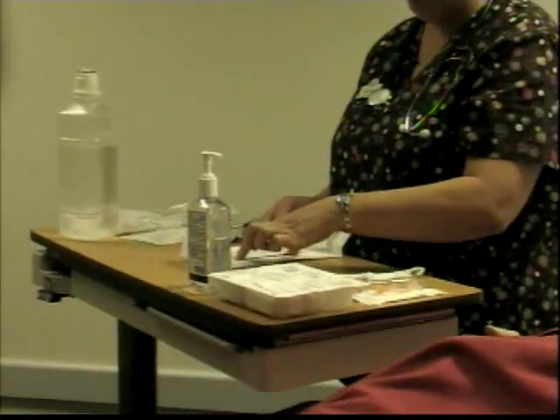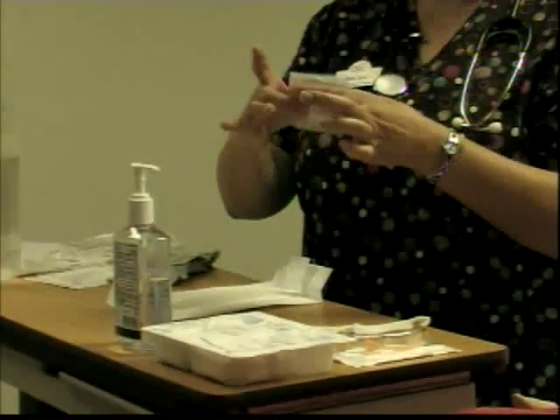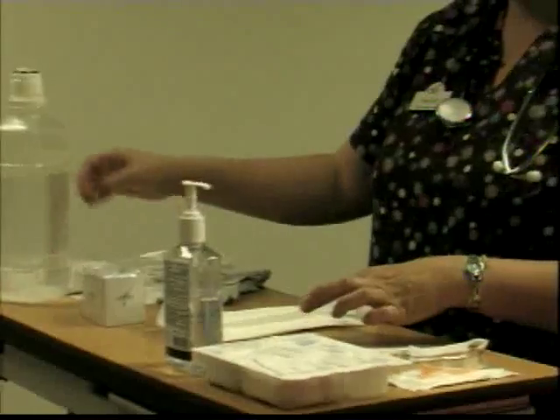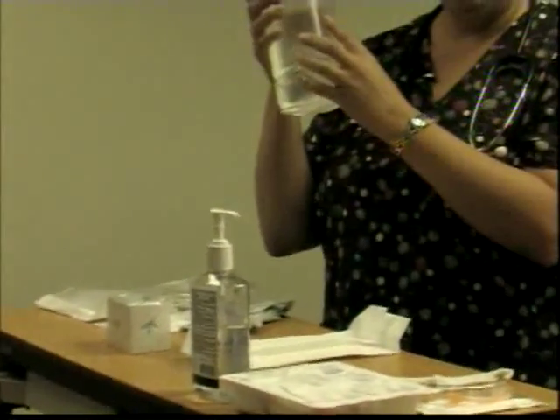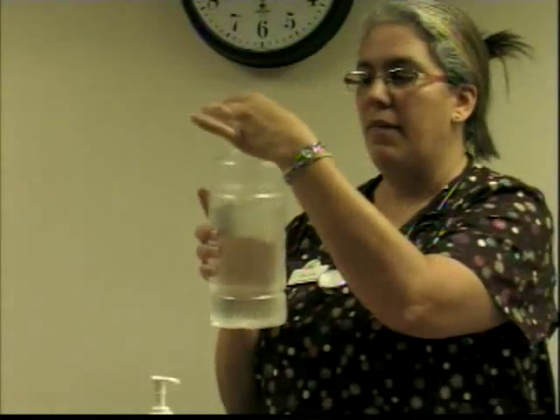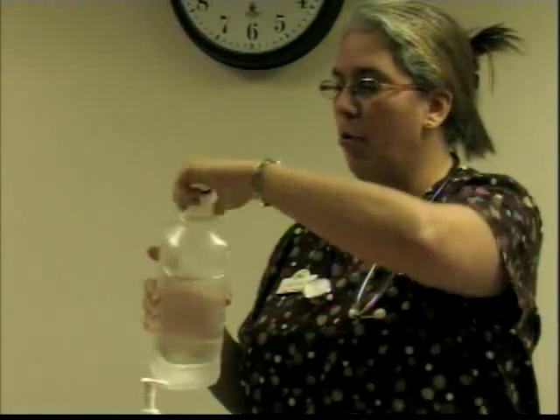We have the little reservoir for the water, for the saline, right here. So you have to put it together, put it on the side. Again, all the things you learned in 11:15 apply. Label in your palm. If it's open, then you want to make sure that you lip it and you clean all the area around before you pour it in there.